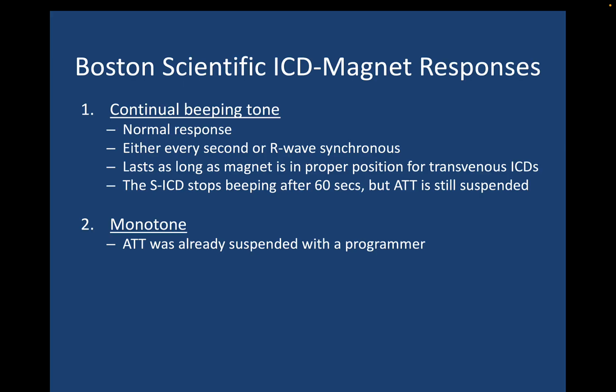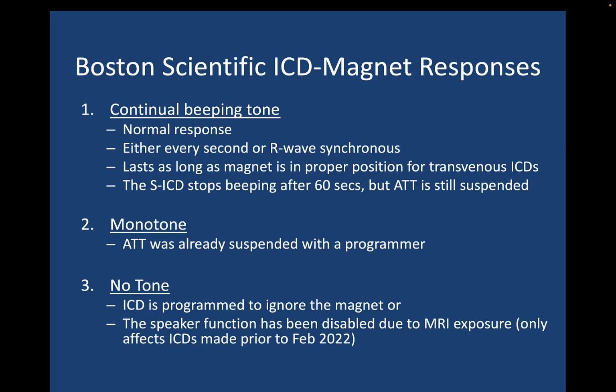And this happens in our scenario where somebody turns off the anti-tachy therapy upstairs before the patient comes down to the operating room, and the nurse doesn't tell us about that. We then put a magnet on the ICD and we hear this monotone. The other response that a Boston Scientific ICD can have to a magnet is no tone. And this can happen in one of 2 scenarios. It can happen if the ICD is programmed to ignore the magnet. That's pretty straightforward. The other potential is that the speaker function could have been disabled due to MRI exposure.